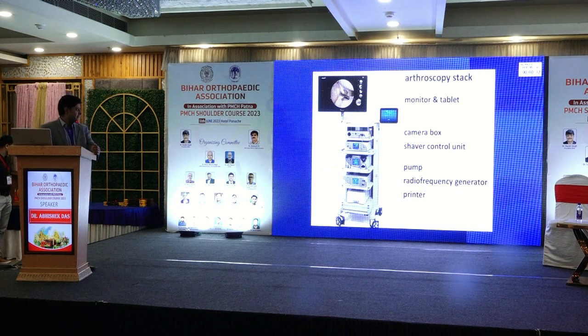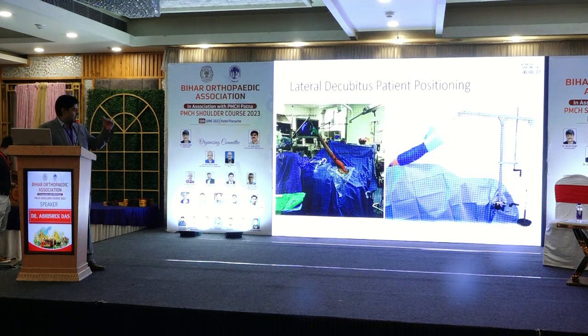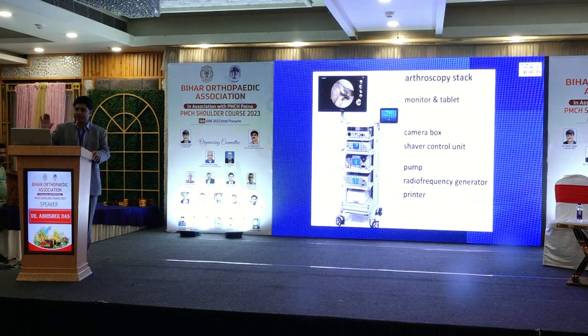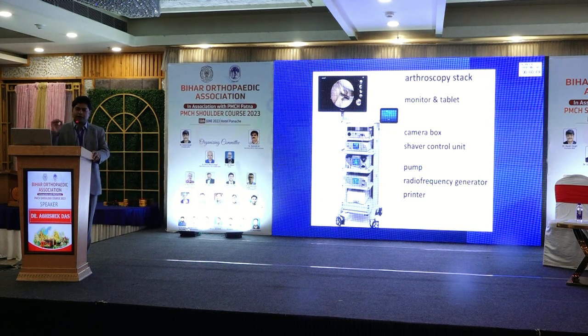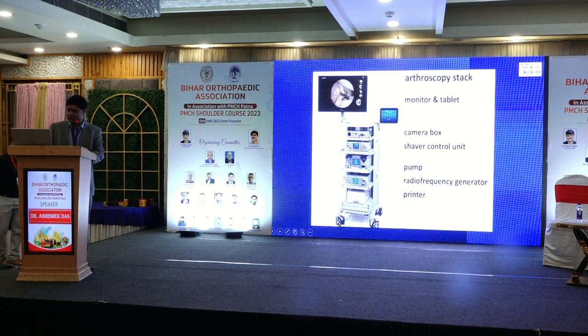Now, this is the stack. This is the placement of the stack. And if you go back to the actual positioning, you'll find that everything is arranged in order: monitor, stack, and that is on the opposite side of the table where you can visualize it without having to tilt and turn too much. So try having this kind of a stack where everything is in order, and train one of the assistants who is good enough to handle all these equipments. When you say, well, I need the pump pressure at this much, he can quickly press a button without you having to focus. Okay. Fine. I'll try to speed up a little bit.